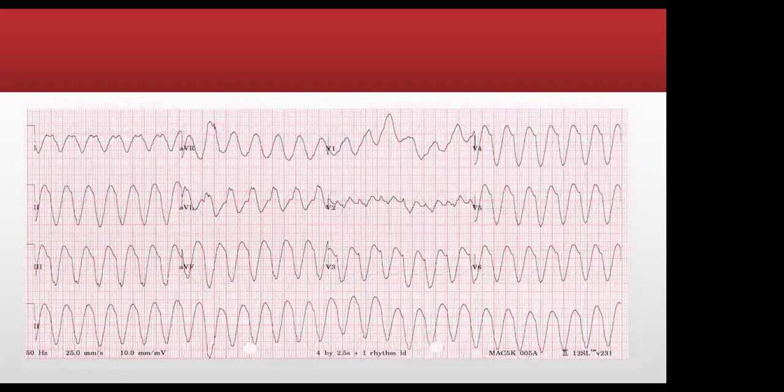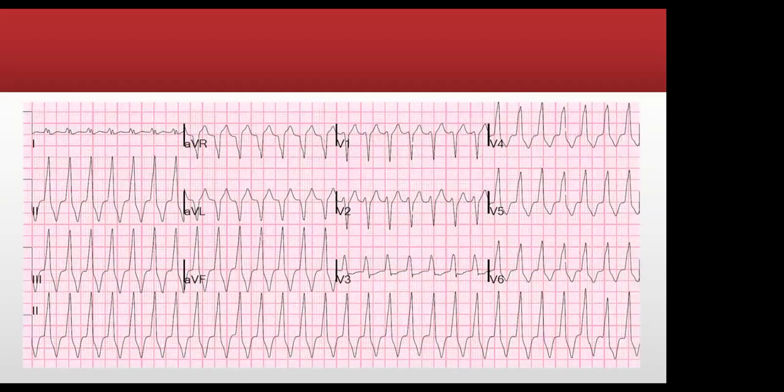I don't know why they say Brugada sign. There are criteria, Brugada criteria, that's the real word. And it has a lot of criteria to look at, which I can't remember all of off the top of my head. They are able to tell you whether you are dealing with an SVT or a VT. So those are usually the 2 differentials that you have. So they have a lot of criteria, and one of them is the Brugada criteria.